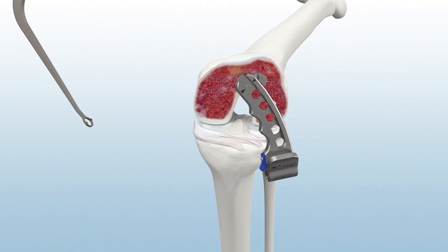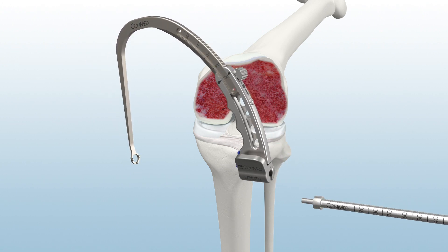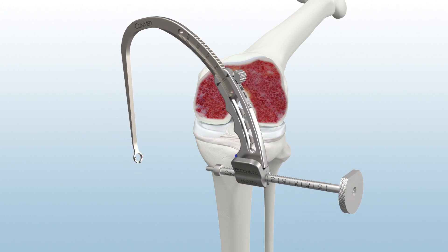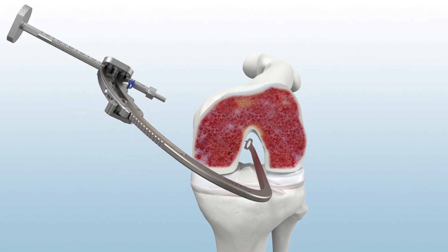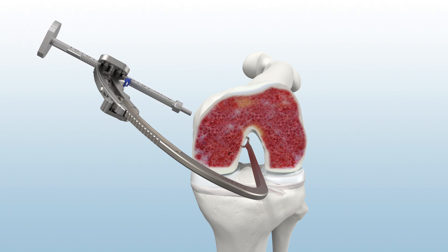Assemble the Infinity Modular Guide System using the femoral footprint guide arm and the all-inside guide sleeve. Through the anteromedial portal, place the footprint of the guide over the femoral PCL remnant and advance the guide sleeve to skin. Once proper trajectory is achieved, make a small incision and advance the sleeve to bone using the ratcheting feature.